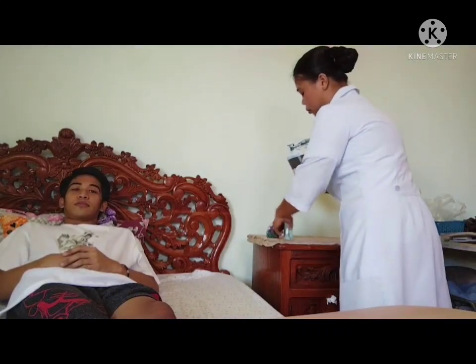For the equipment, check for oxygen delivery device as ordered by healthcare provider, oxygen tubing, consider extension tubing, humidifier if indicated, sterile water for humidifier, oxygen flow meter, oxygen source, and appropriate room signs. Bring necessary equipment to the bedside stand or over bed table.